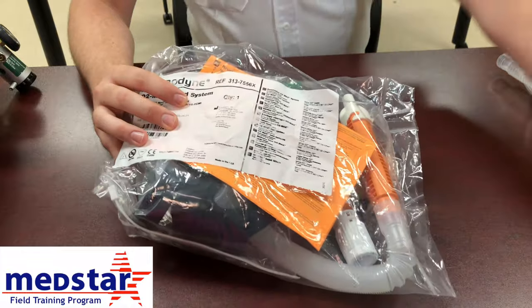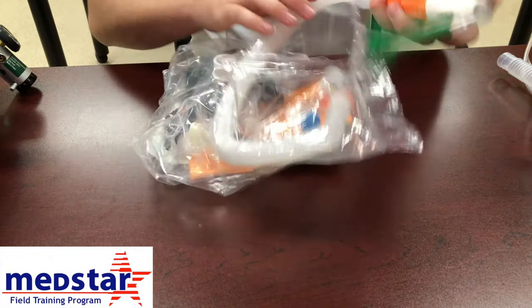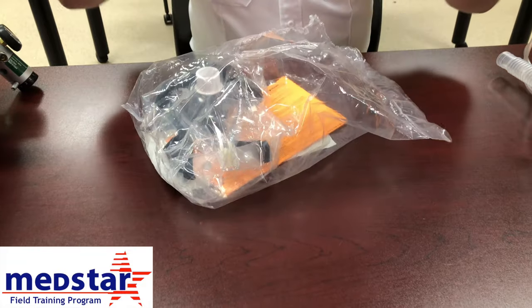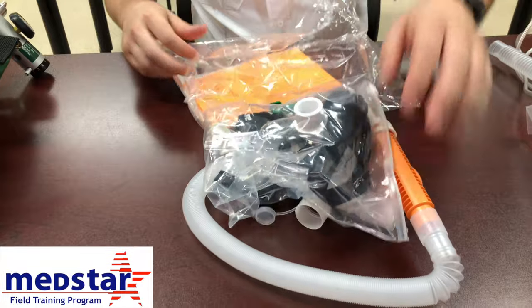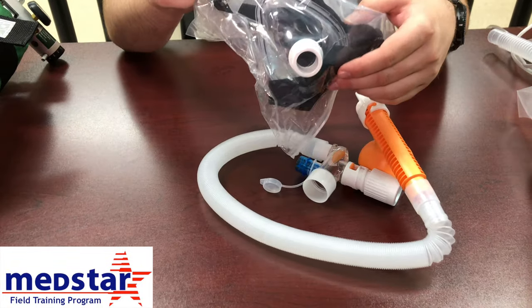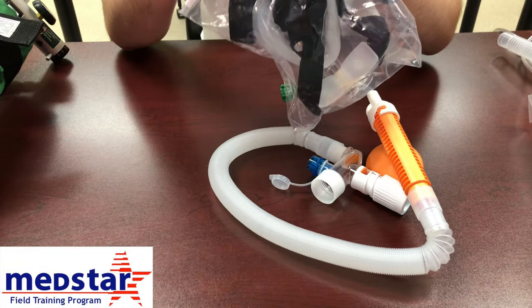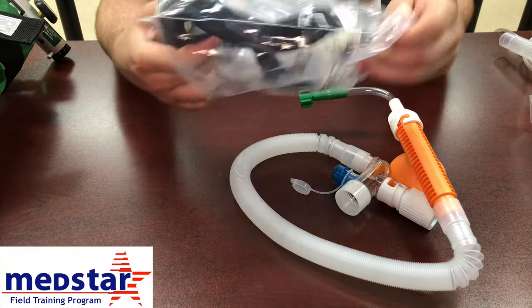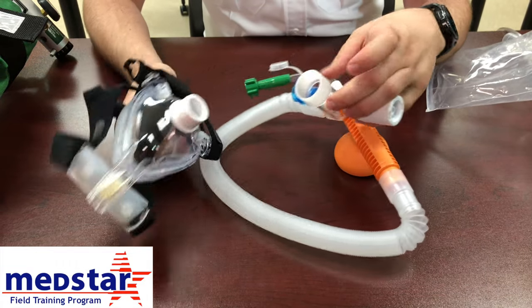When you open the package, there is tubing and a mask inside. The only difference between the two sizes is the mask itself. To attach the mask to the tubing, take the mask out of the bag and it simply plugs right into the tubing.